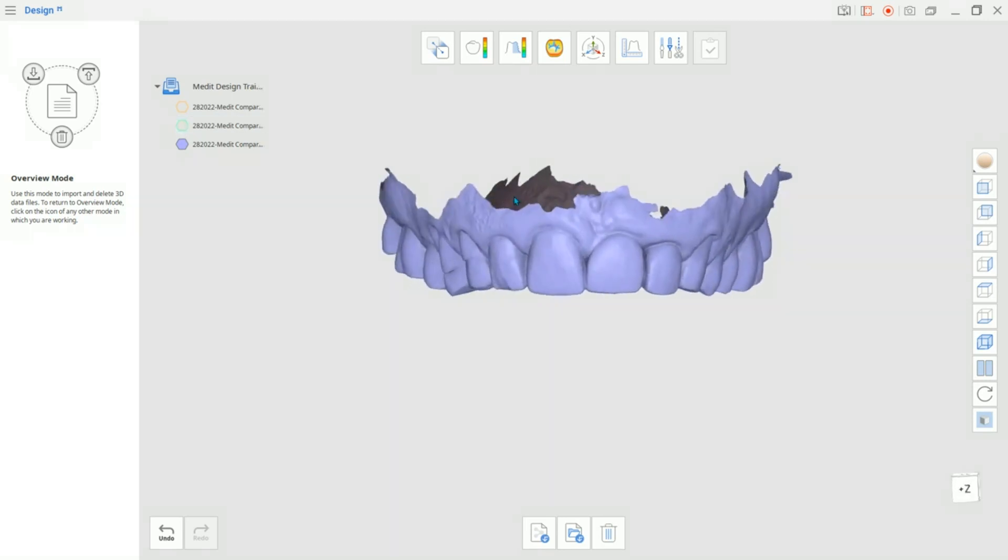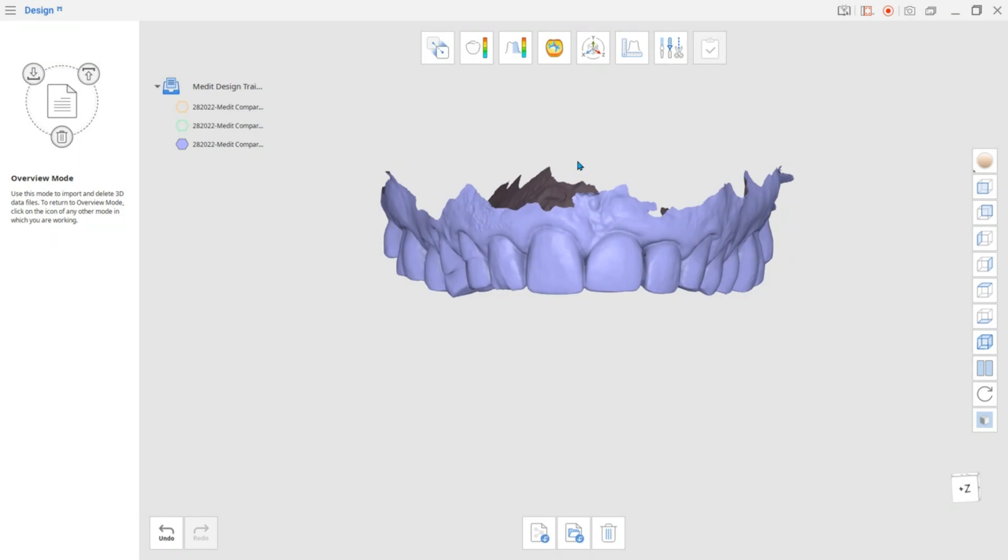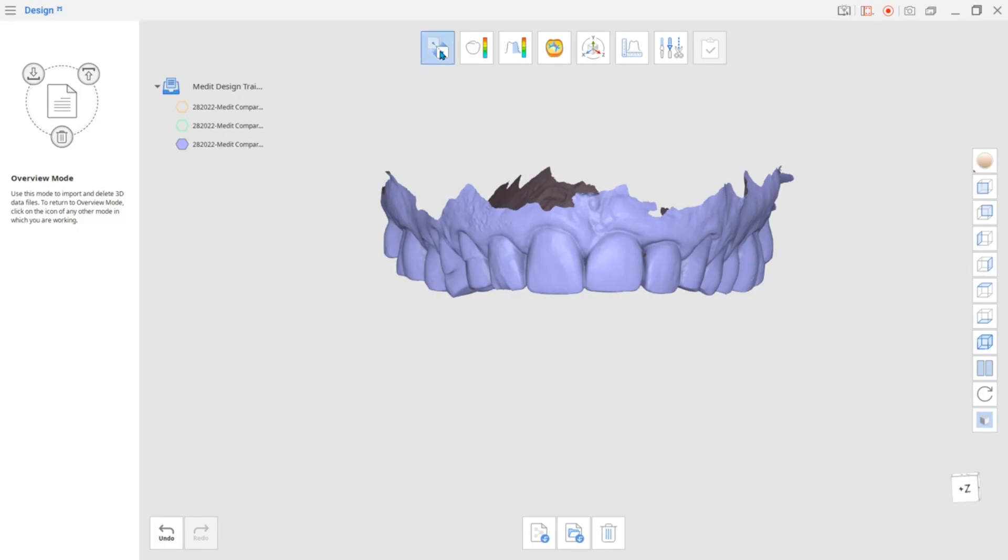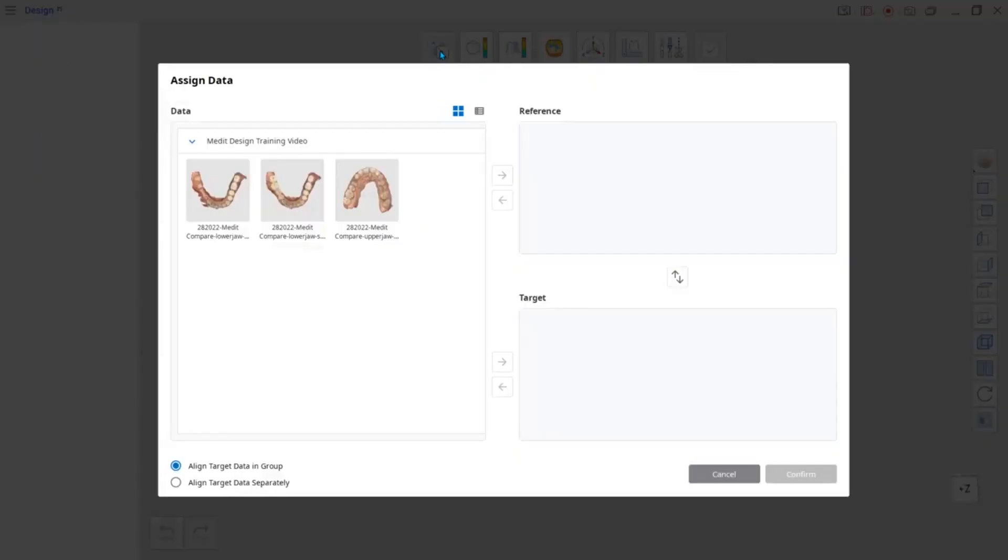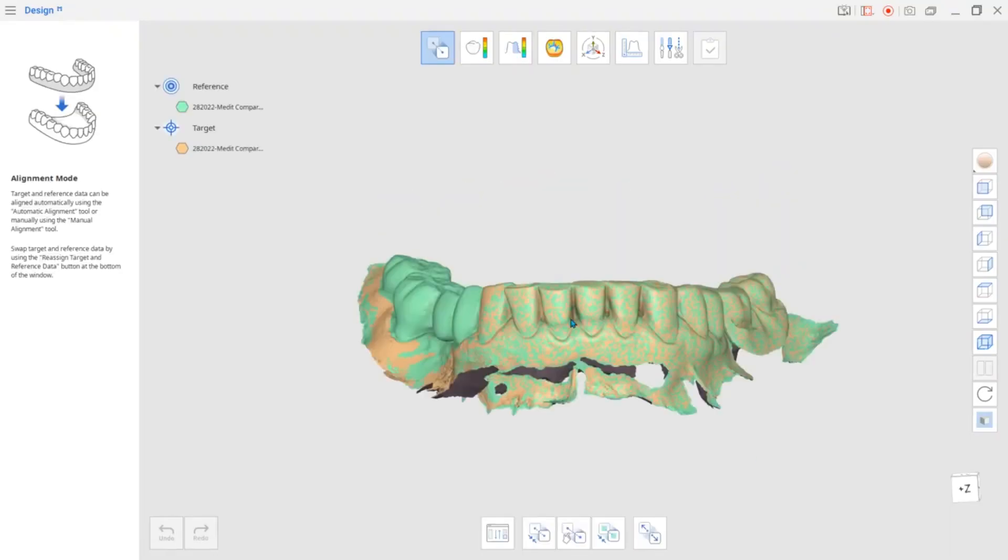Now that the data is prepared for work, let's take a look at the modes available in the app. First up is the alignment mode. If you have to compare data, you can first align it in this mode.